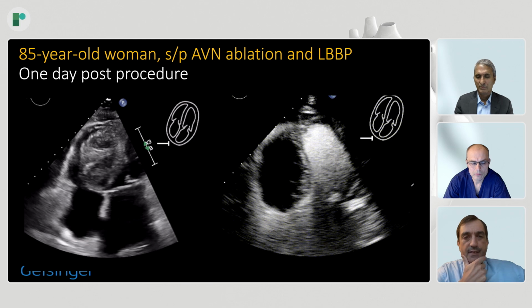And septal hematoma has occurred in just 3 patients in my experience, with more than 1,000 patients included. But obviously there are reports in the literature of this rare complication. In my own experience, the cases that I have had have spontaneously resolved, and none has been as dramatic as this one shown by you.